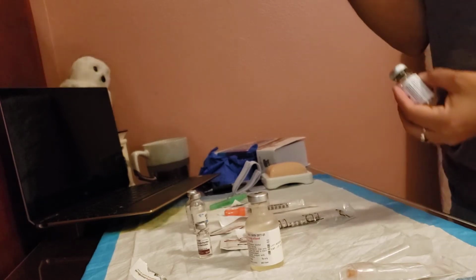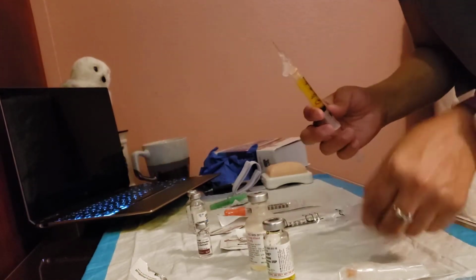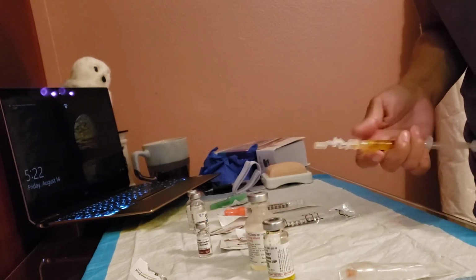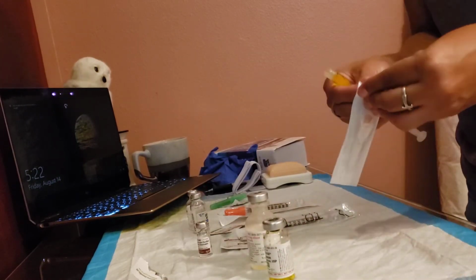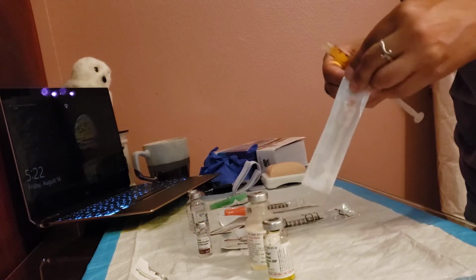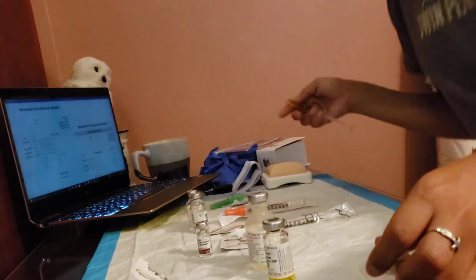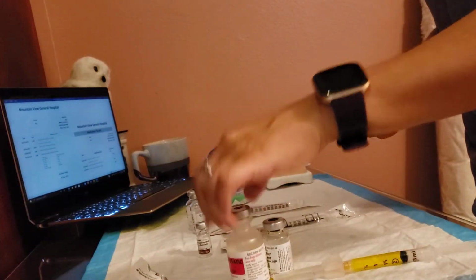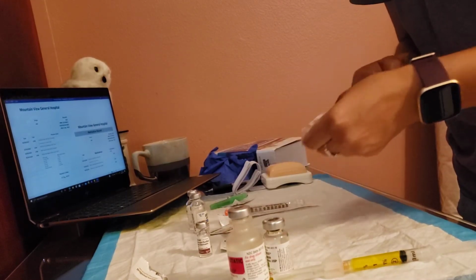So that's my 2.5 of my Ceftriaxone, and I'm going to put the safety on because I'm not going to use that needle on my patient, and I'm going to throw this away in the sharps container. I'm going to open my new needle that I will be using on Mr. Buzzard, close it off here, and it's ready to give. And again, like I mentioned, if I wasn't in the room, then I would label this.